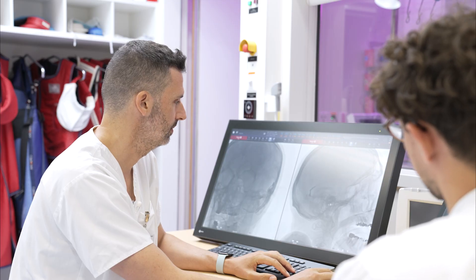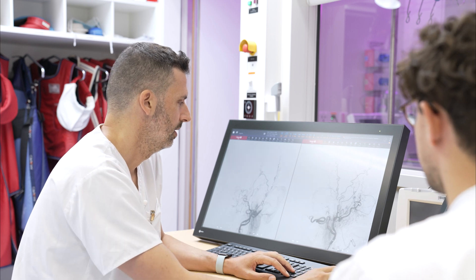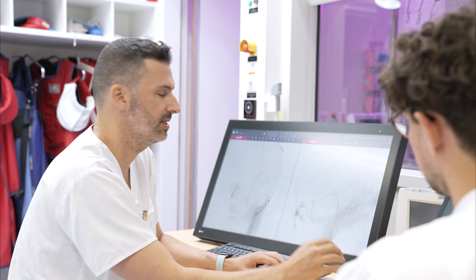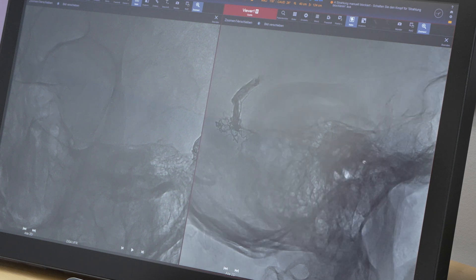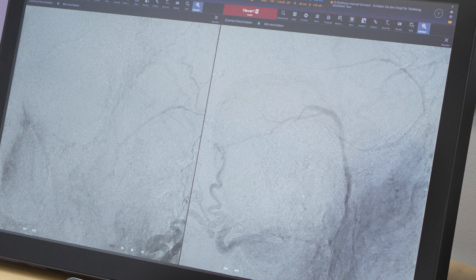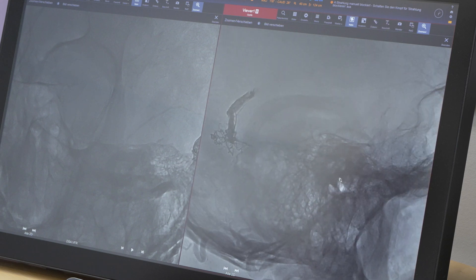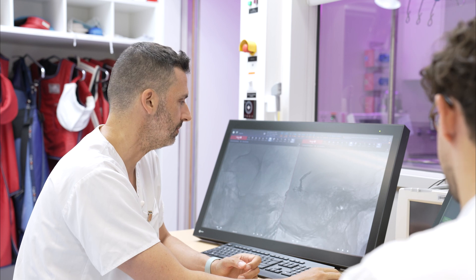When you hear about fistula embolizations, many people say be careful of the facial arcade. We are always aware of it and try to use our liquid embolic as far away as possible. On the native image you can see we are actually far away from the facial canal, so it's not dangerous in this case. Here is the inner ear, and the facial canal and nerve run along this way — so if you have a fistula near this position you have to be aware of possible complications.